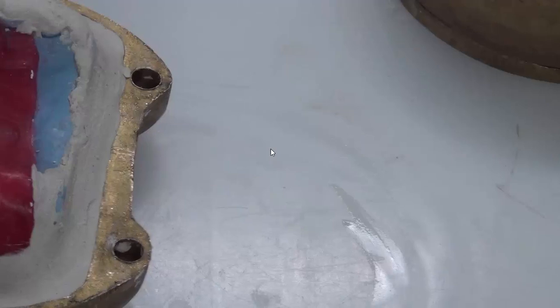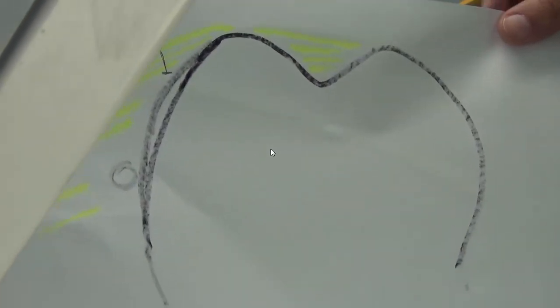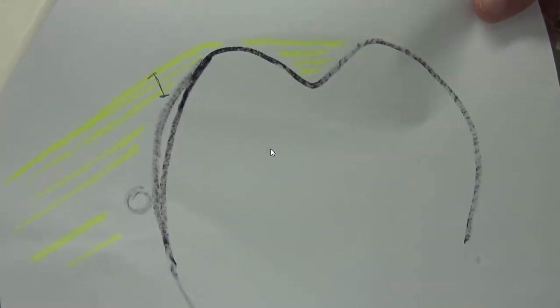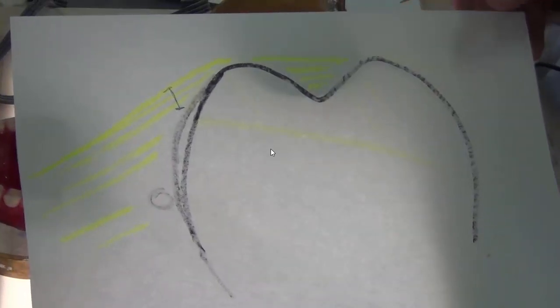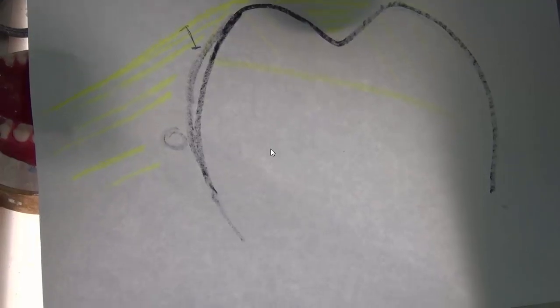I had a question: why do we need to cut the teeth before we add in the plaster? If we take a close look at this drawing, suppose this is a tooth, and you know that the tooth has the occlusal surface, you have the buccal undercut, and you have the wire. If I add plaster over this, I will have a very small margin of plaster, and I will have some edges that are thin. And these might fracture while I'm doing dewaxing or depacking or deflasking at the denture stage.